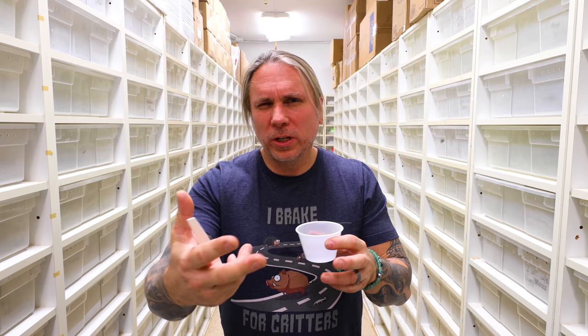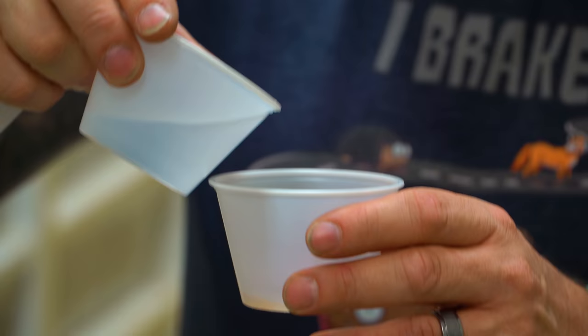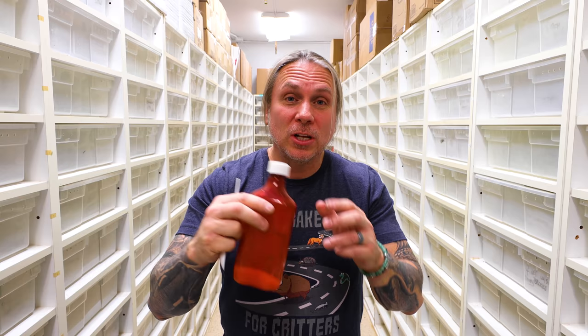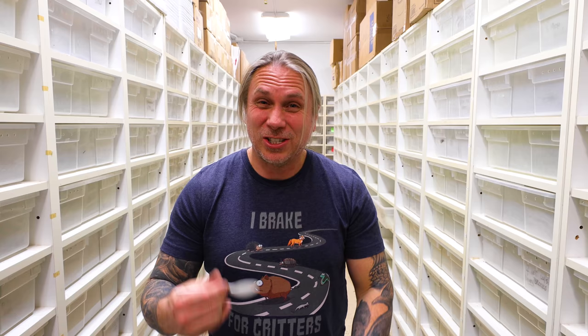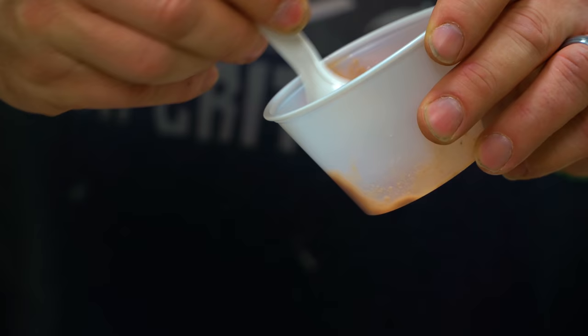I've actually showed this technique before but not on this interesting snake. This is basically a prescription cat food from Science Diet — it's medicated. You do need a prescription to get it but our vet gives us the opportunity. I want to mix it with a little bit of water to make it into a slurry because it's a little too thick to tube a snake right now. This is liquid flagyl, or metronidazole, and I'm going to put just a little bit in here — that's going to help cure any stomach ailments, flagellates, stuff like that. I'm going to mix this up really good.